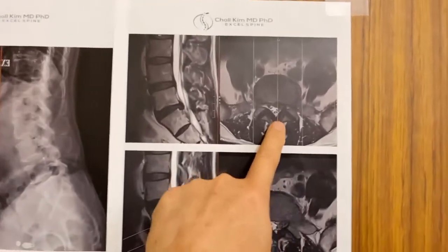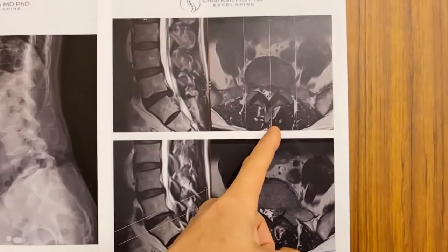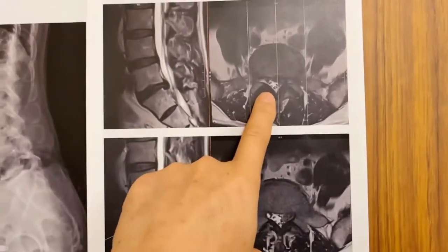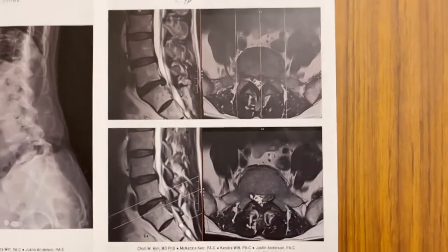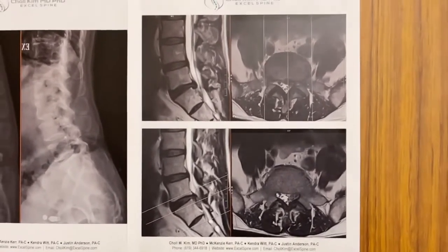Anyway, he's got this disc herniation, so we'll use the Laser Endoscopic Technique, the LES procedure. Create a little poke hole, use the spaghetti noodle dilator to enter the canal through the interlaminar approach. We'll remove that disc herniation, remove any loose fragments, make sure that his nerves are totally free, because with any kind of disc herniation, the inflammatory process of healing scars everything down, and then put a little bandaid on there.